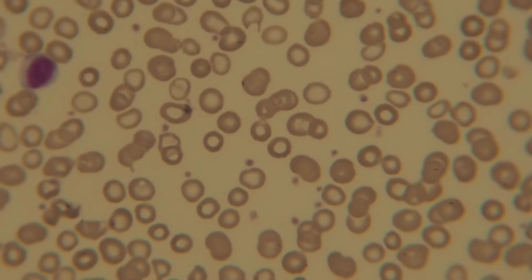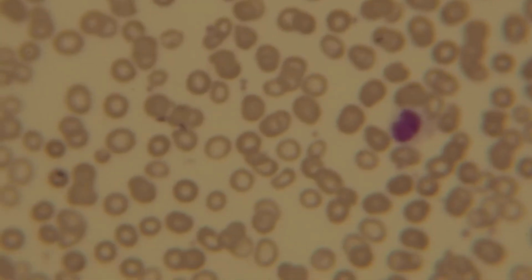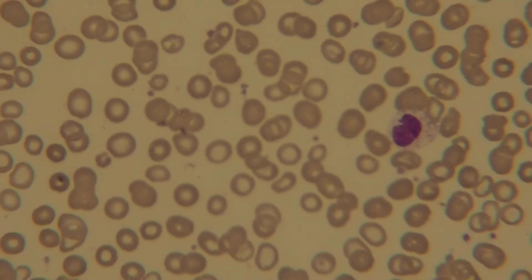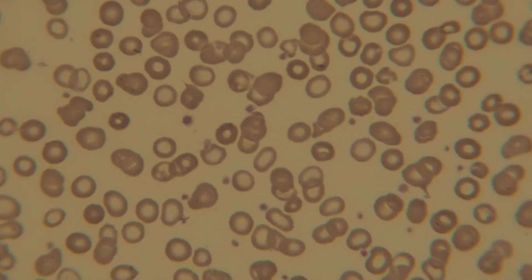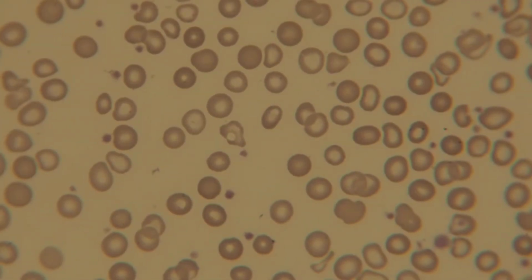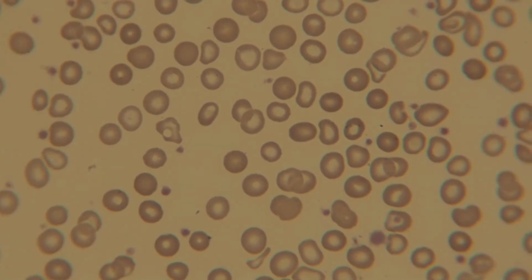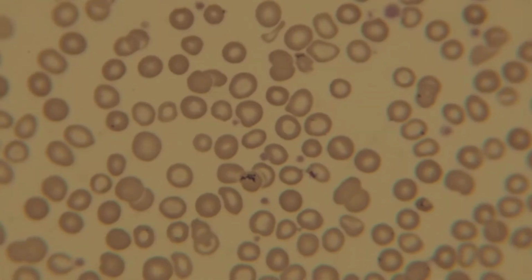Okay, so let's do this manual diff, but I actually selected this slide mostly because of the RBC line. Let's go to a little less dense area to start. There's some poikilocytosis.